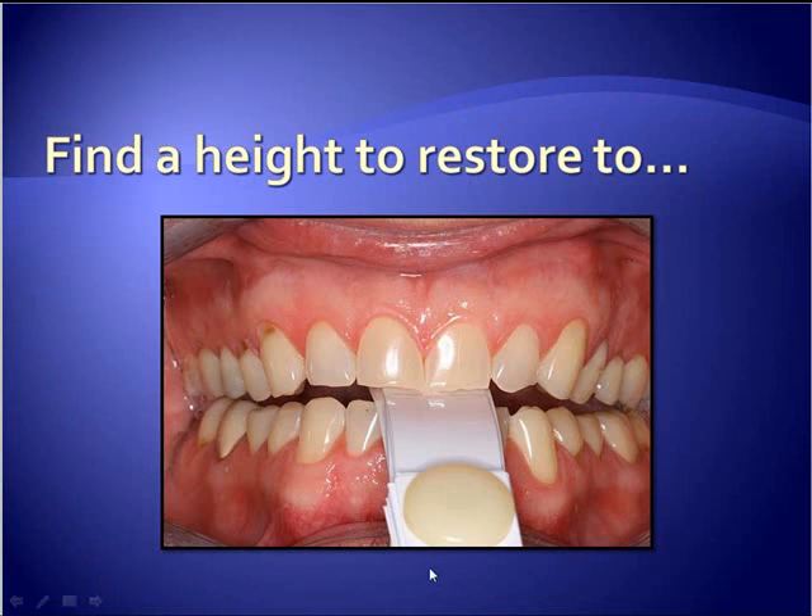This is that leaf gauge I told you about. It's a device sold by Great Lakes Orthodontics Laboratory that allows you to alter the number of leaves in the gauge to open the bite up to where you believe it should be, which would enable you to restore the dentition. This is a method I learned from Dr. Frank Speer and has proved invaluable.